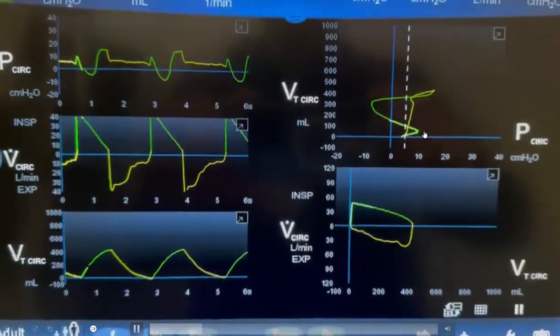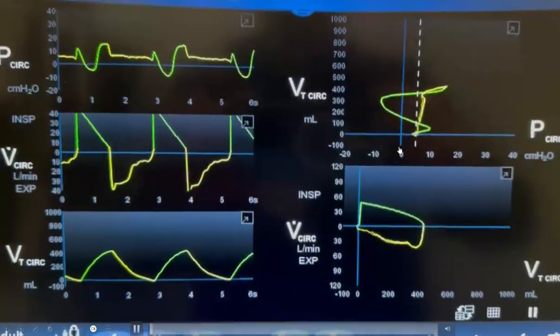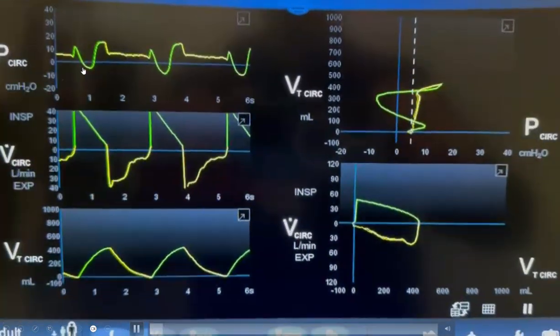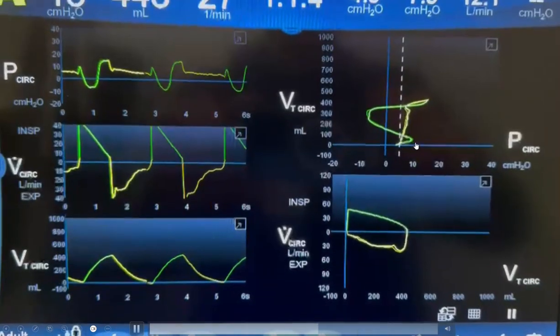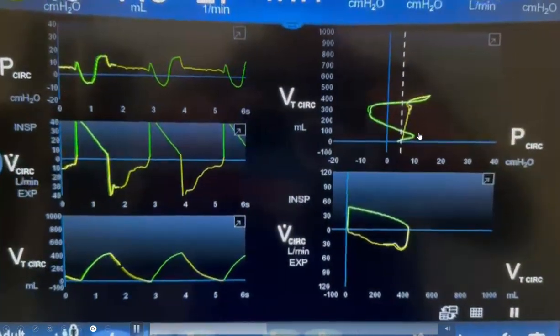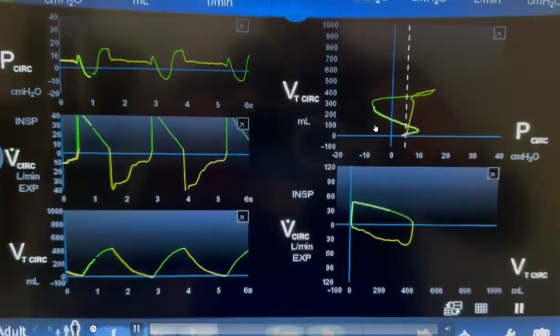Then the pressure starts to go up to around 10 centimeters of water. This point here, the increase in the pressure from this point to this point, correlates with the initial rise in the pressure here. Then the pressure is pulled down—it goes down from 10 centimeters of water all the way to minus 7 or minus 8 centimeters of water.